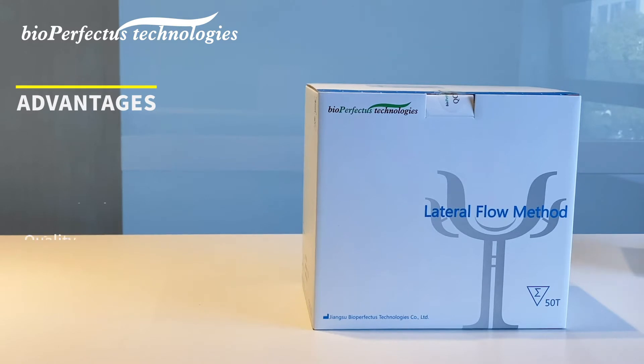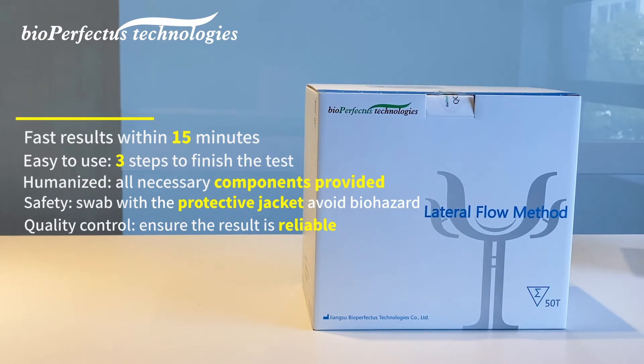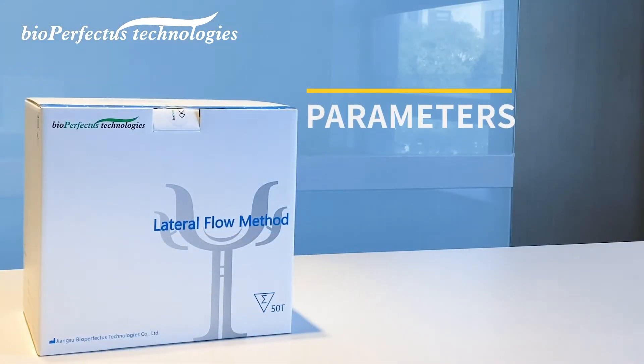Advantages: fast results within 15 minutes, easy to use with three steps to finish the test, humanized design with all necessary components provided, and a safety swab with a protective jacket to avoid biohazard. Quality control ensures the result is reliable.